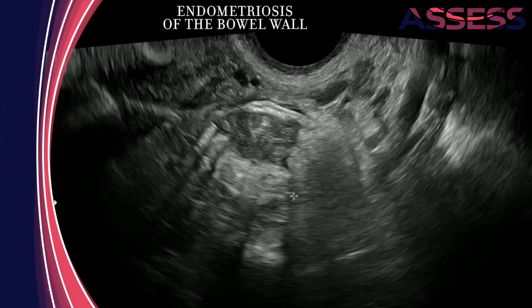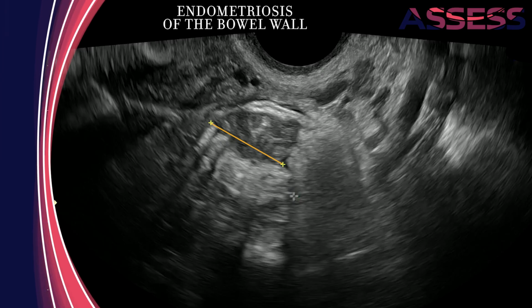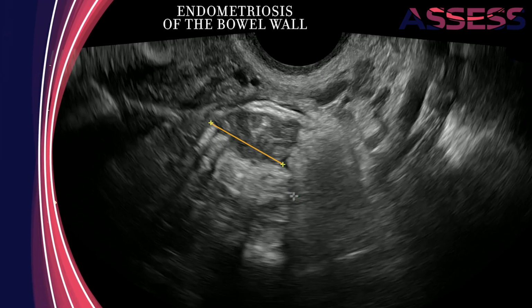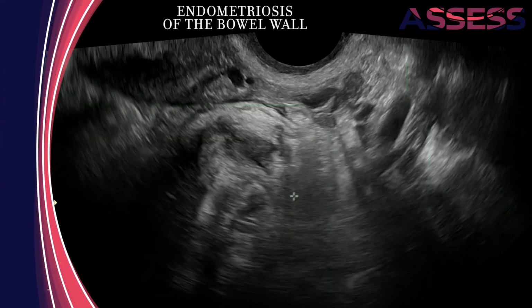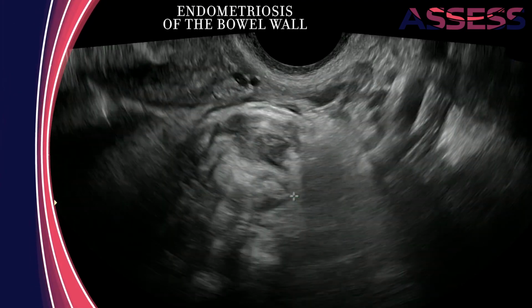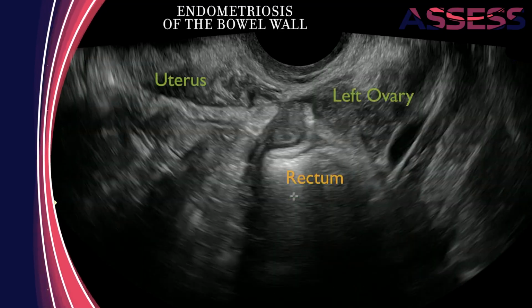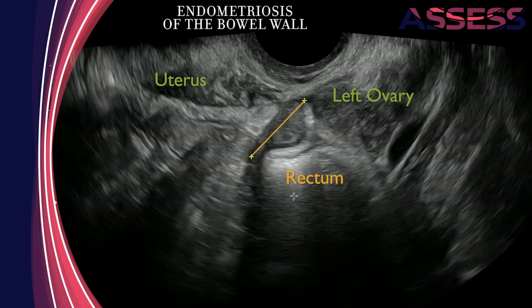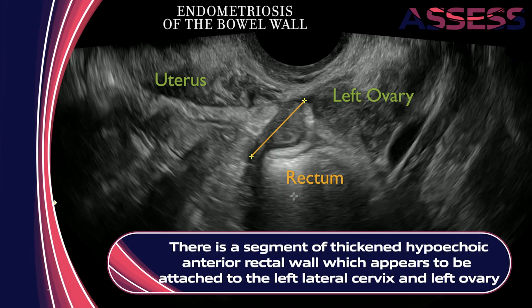Find the widest point of the hypoechoic thickening of the wall and place calipers on each end of the area. Include all of the thickened hypoechoic area up to the normal thin bowel wall. There may be more than one area of endometriosis on the rectum and sigmoid colon, so follow as far as possible to determine if there is more extensive disease and measure each region in the same way. Each area of endometriosis should be imaged and annotated with the anatomical region.